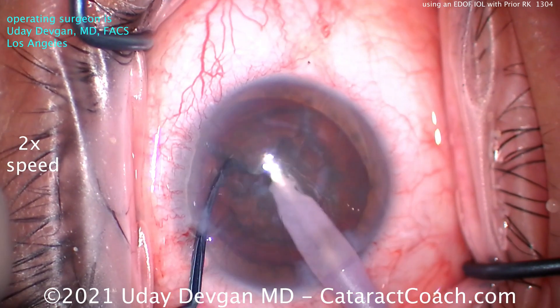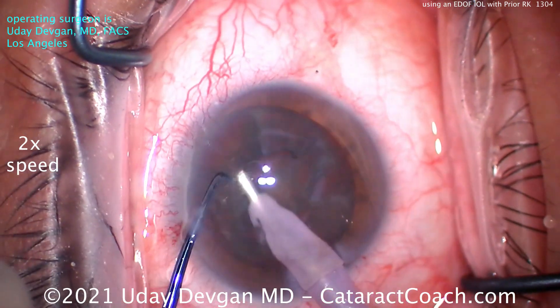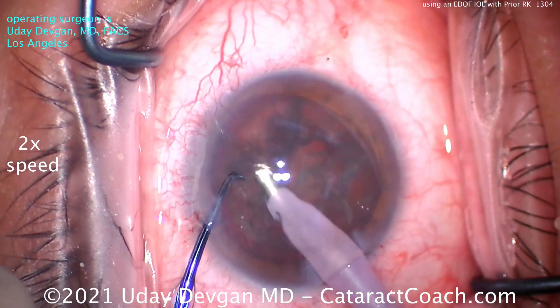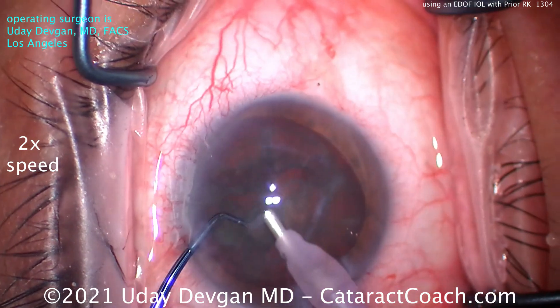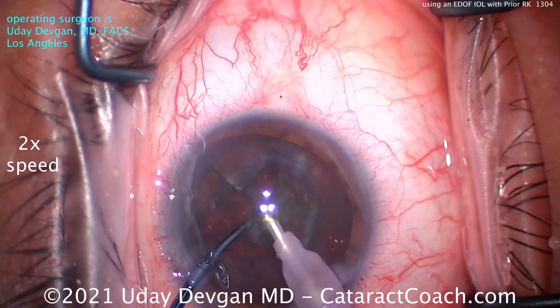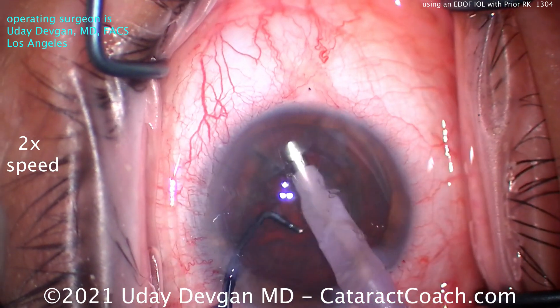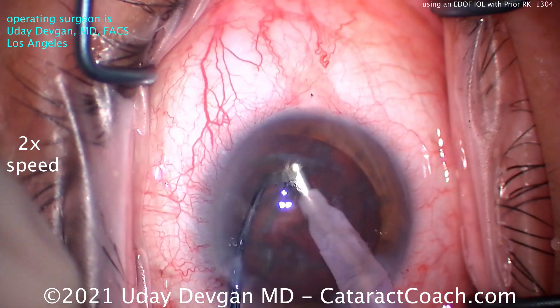We're going to do the cataract surgery — we've obviously sped up the video here. You can see it's not a very dense cataract; it's kind of mushy, just trying to get the pieces up and remove the cataract. The interesting part of the surgery, of course, is not just removal of the cataract, but the choice of the EDOF lens. Let's talk a little about the calculations.